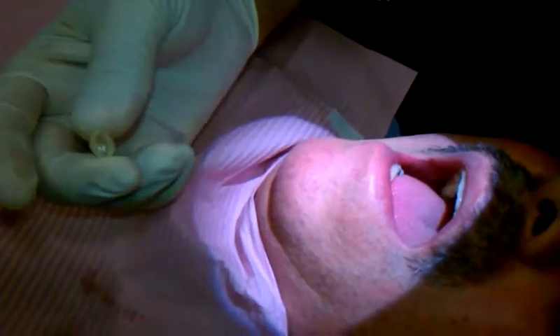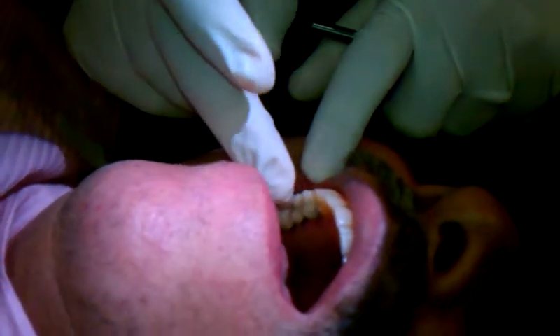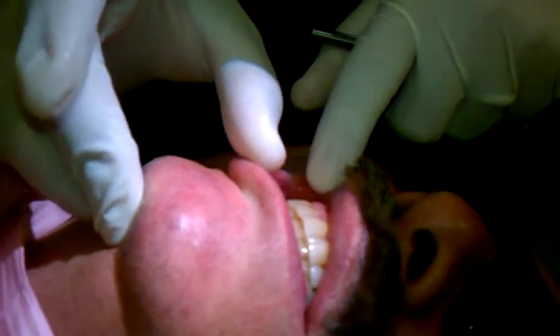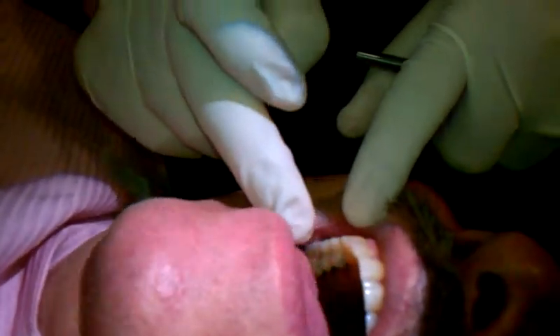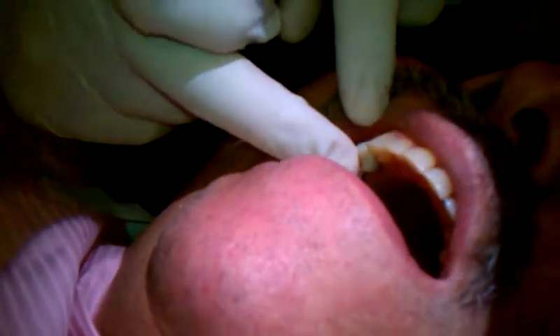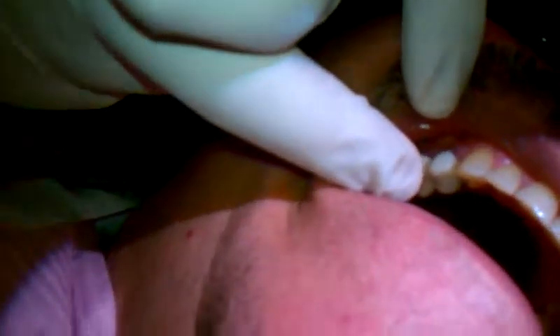As you saw, it literally took maybe about a minute to clean it. And then once I put it in the patient's mouth — tap, tap, tap — the occlusion should be good, the fit should be really good, and the patient is ready with a temporary. Of course, I'm going to cement this with Temporan.